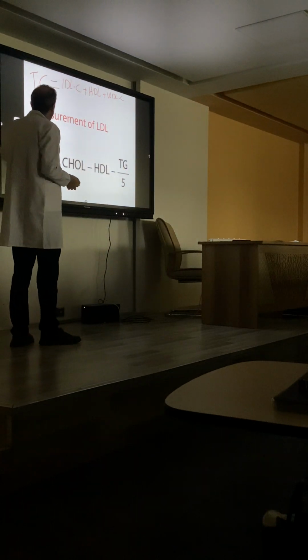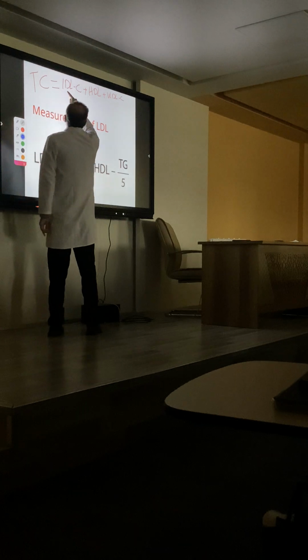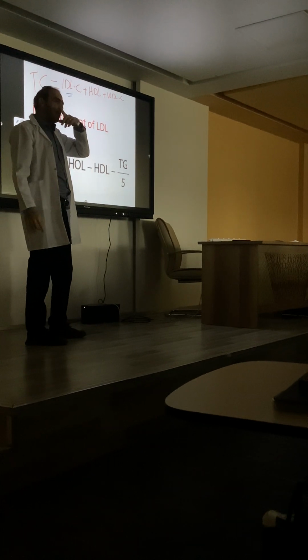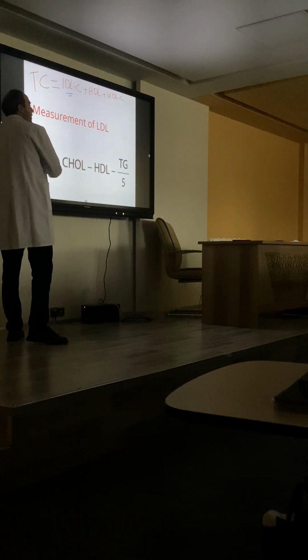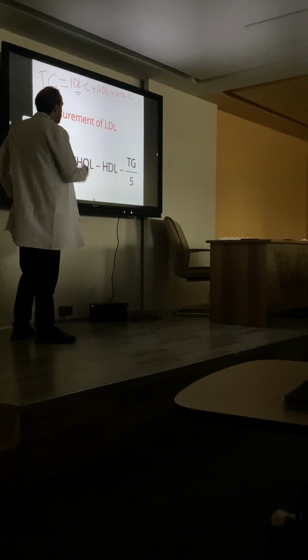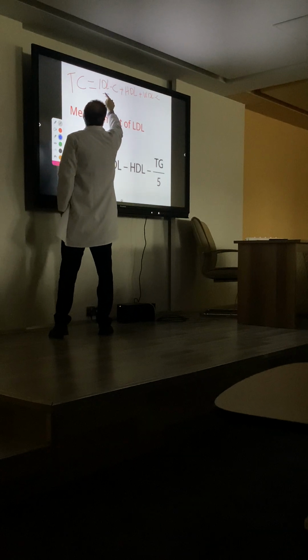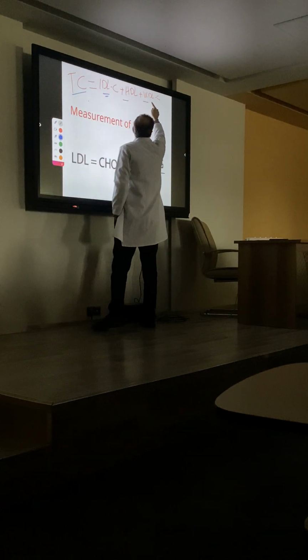Here in Iraq, we couldn't find a kit for measurement of LDL directly. But as I mentioned in the theoretical part, we have a formula known as the Friedewald equation. With this formula, we can measure LDL based on knowing the total cholesterol, HDL and VLDL.